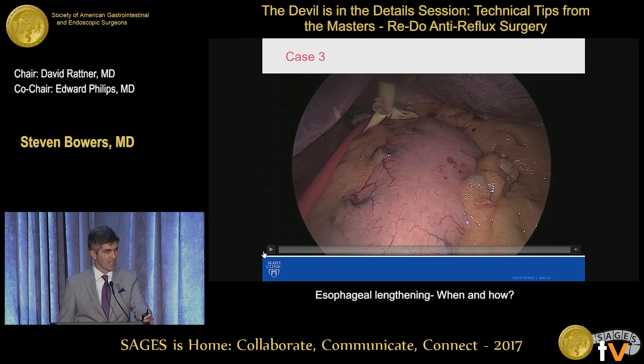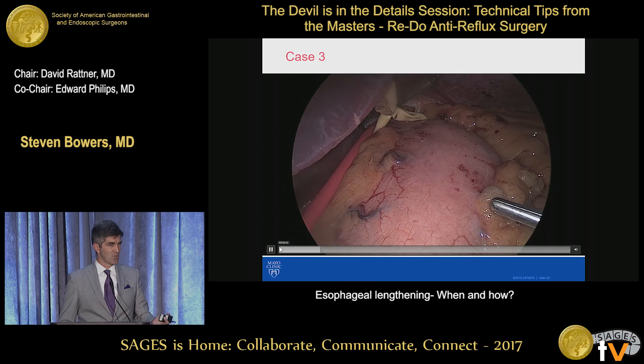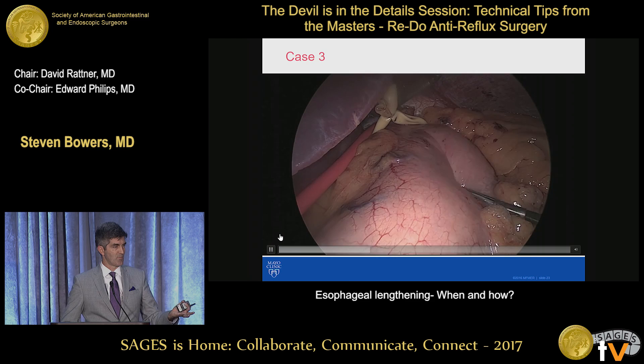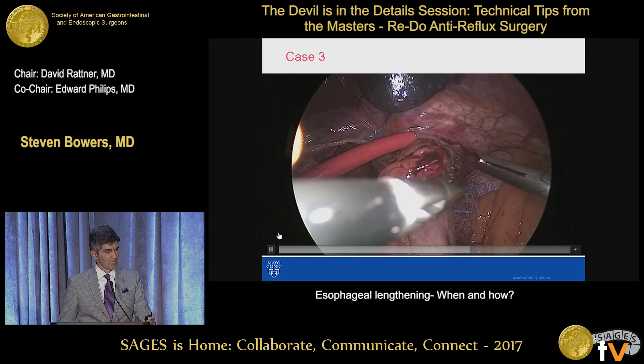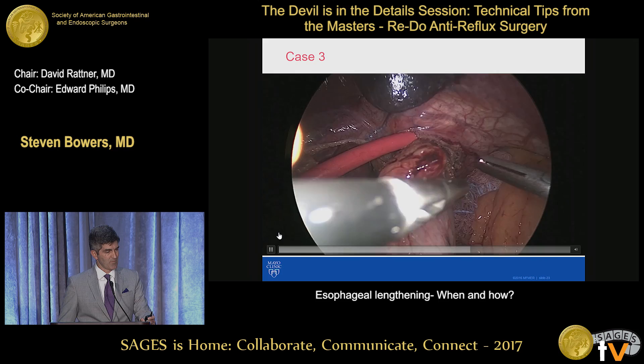So what do you do with that? I didn't want to place a bougie — this patient needed a Collis. So I did upper endoscopy, and I think this is a lesson: if you're not prepared for some reason to do a Collis but the patient needs it, then it's simply okay to close the crus and come back another day — refer that patient out, or simply not just accept that wrapping the cardia is okay. Here there was about a centimeter of esophagus, a small segment of tubularized cardia, but this patient really needed a Collis gastroplasty.